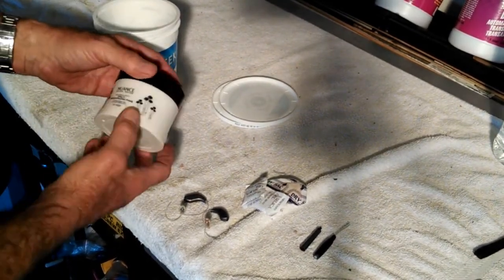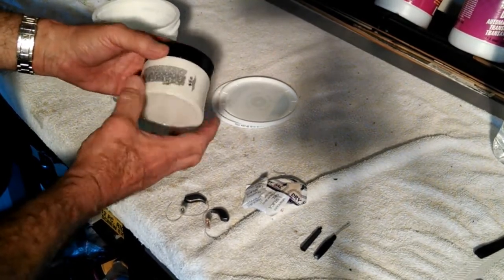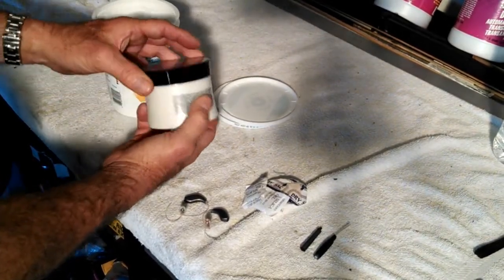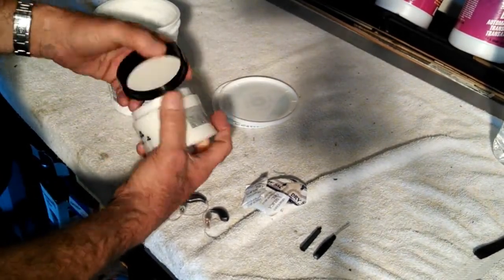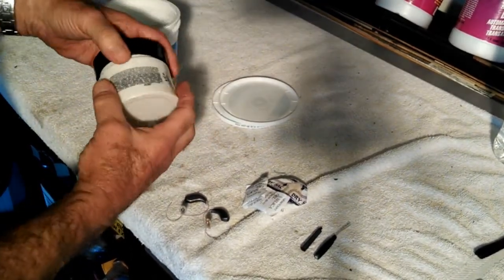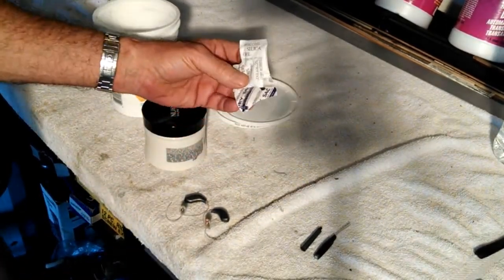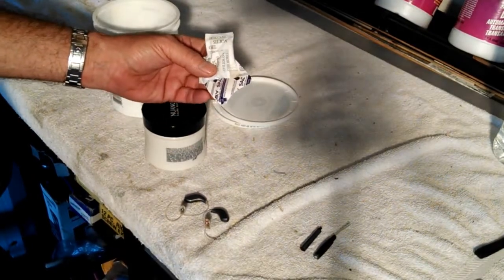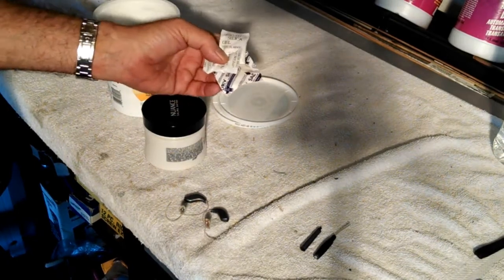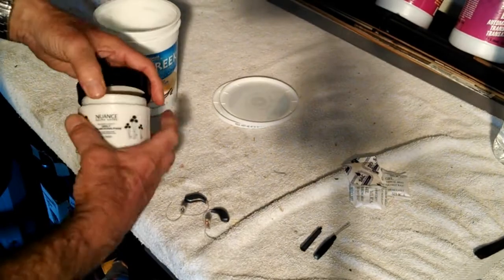This is a jar from one of my wife's face treatment products. It's a good, strong plastic — I could drop it, it's got a good seal, it wouldn't break. These are desiccant packs that come in a lot of the products that you buy every day and you usually throw them away, but you can recycle them this way and make your own hearing aid dryer.